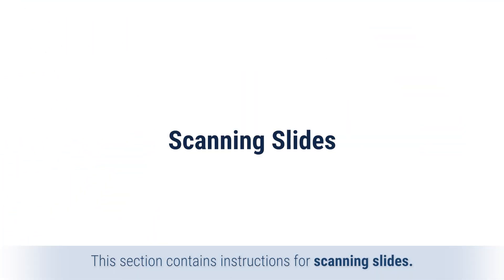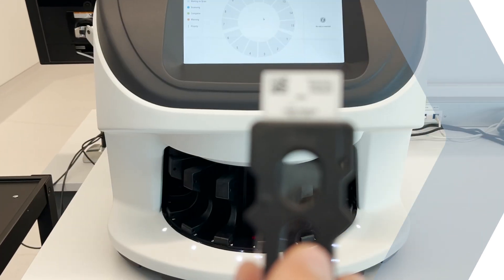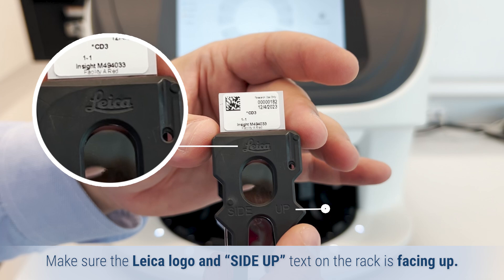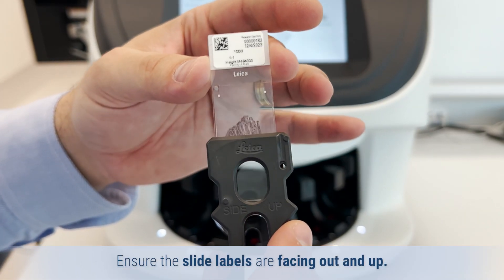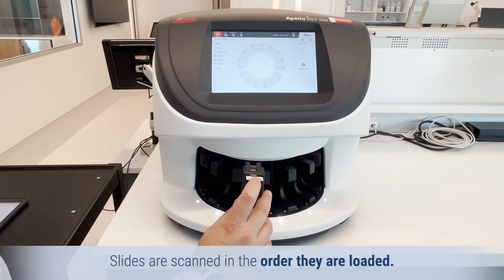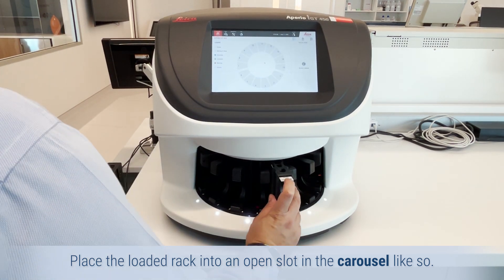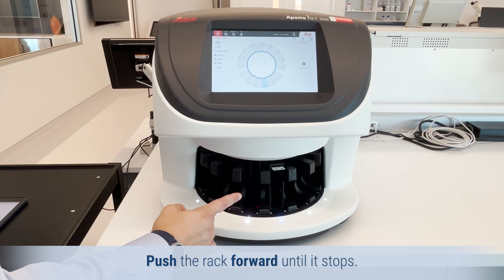This section contains instructions for scanning slides. Make sure the Leica logo and 'side up' text on the rack is facing up. Ensure the slide labels are facing out and up. Slides are scanned in the order they are loaded. Place the loaded rack into an open slot in the carousel like so. Push the rack forward until it stops.